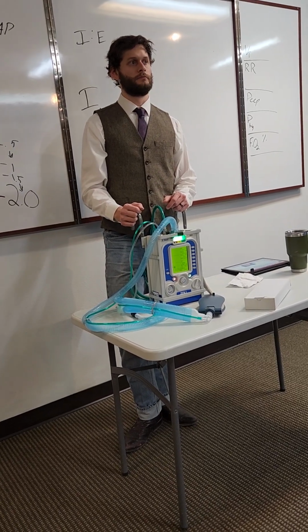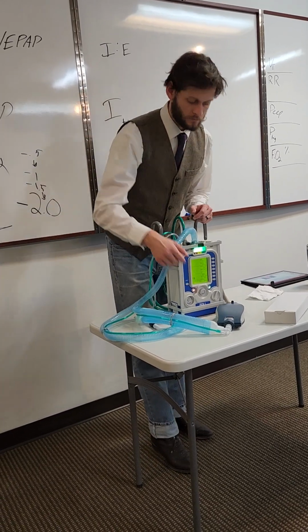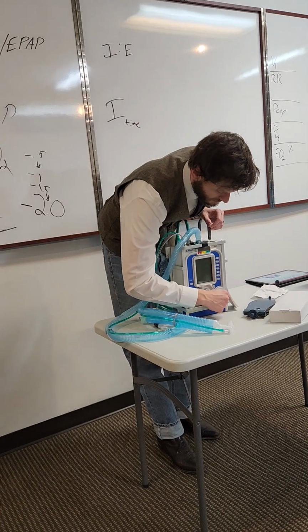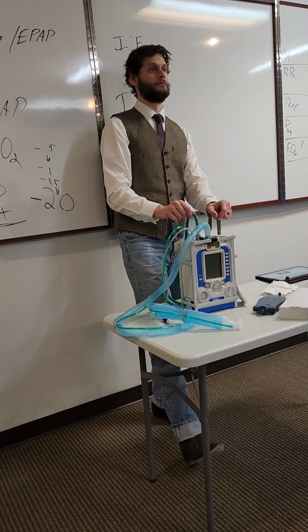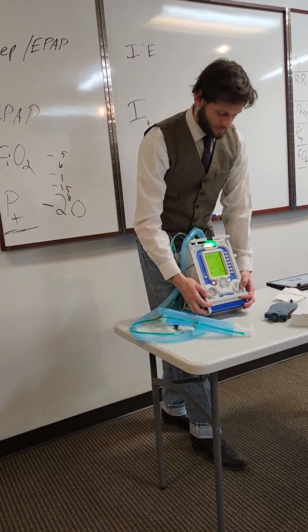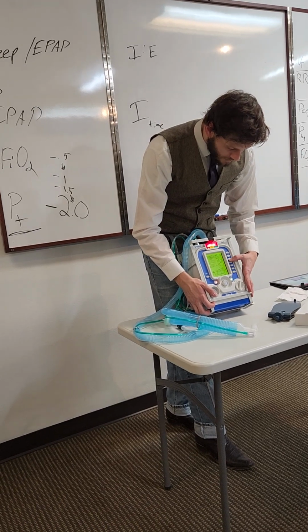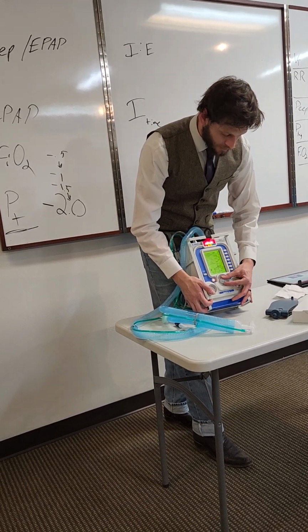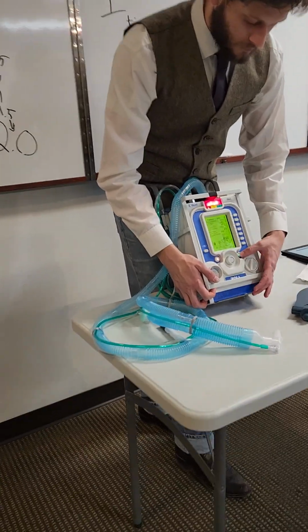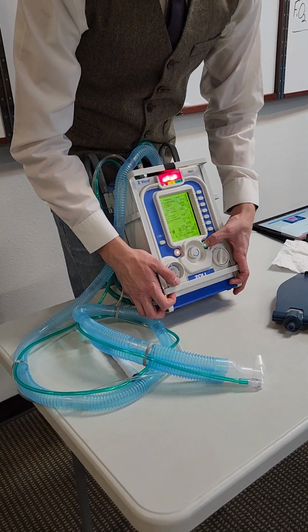Thomas, how long do you have at the beginning to put the settings on without having the lung on? So it's going to throw the low pressure alarm, right? So if we turn it on and click adult, now it's going to give one alarm, and we're just going to go ahead and start setting stuff. So we're going to change it to 10 breaths, and turn it to 16.